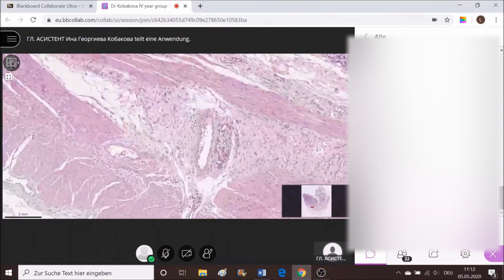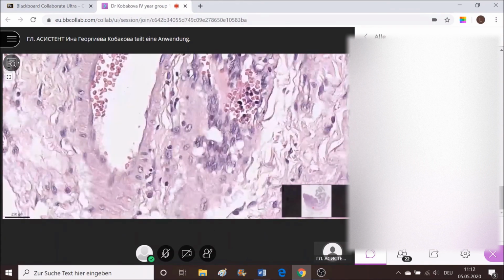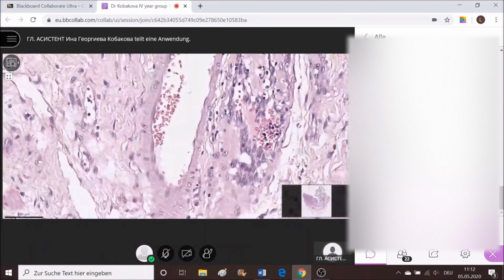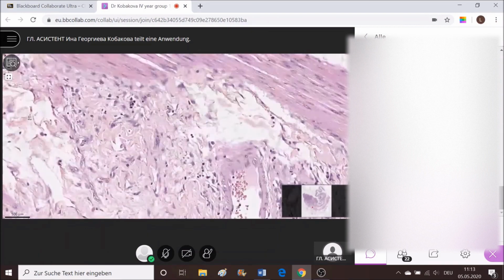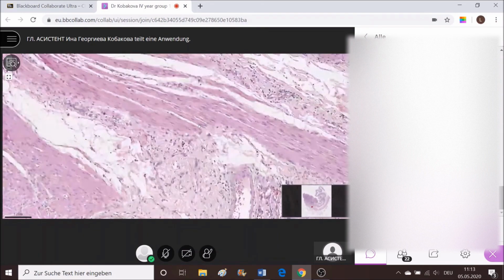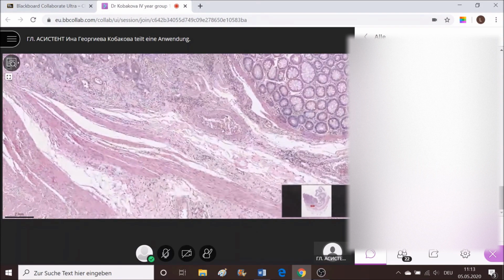And what is that here? That's a very good field now. Take a look at this field. It's perivascular invasion of tumor cells. It appears to look like this. So this could give rise to tumor emboli and finally metastasis.